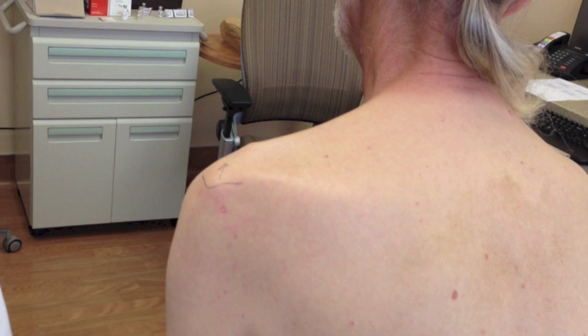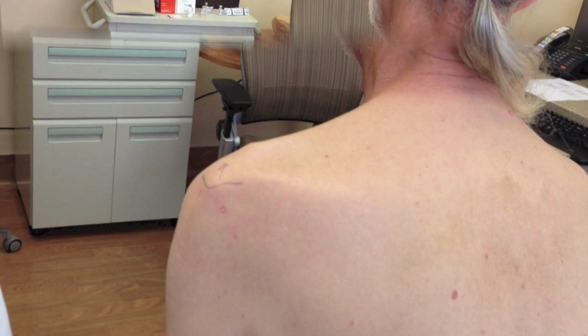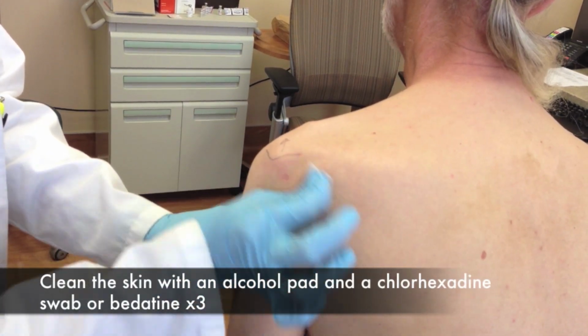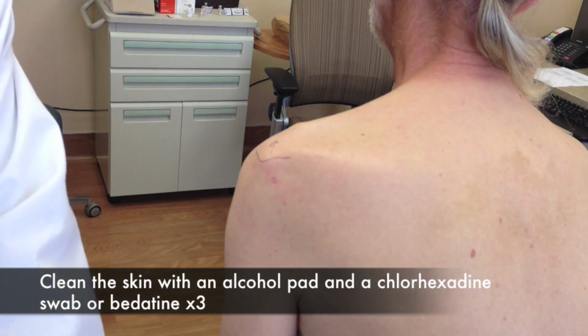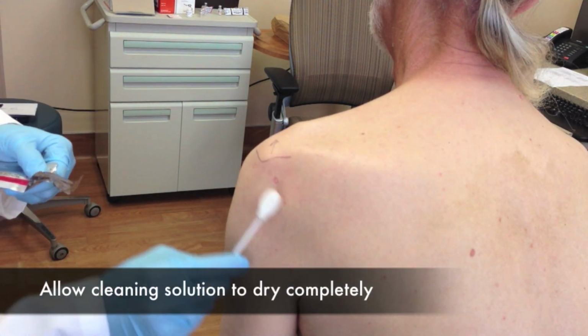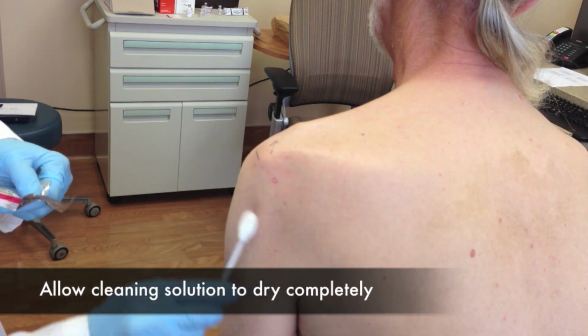It may also be useful to have the patient sit at the edge of the exam table to allow their arm to dangle freely and allow gravity to open up the subacromial space. Clean the skin with an alcohol pad and a chlorhexidine swab or 3 betadine swabs. You should allow the chlorhexidine or betadine to dry completely before proceeding with the procedure.